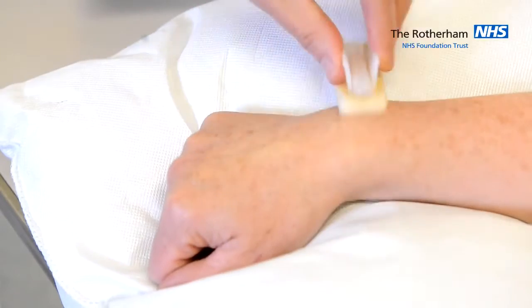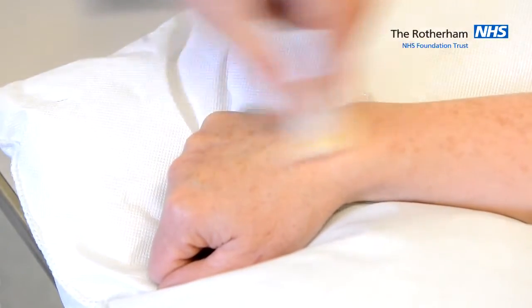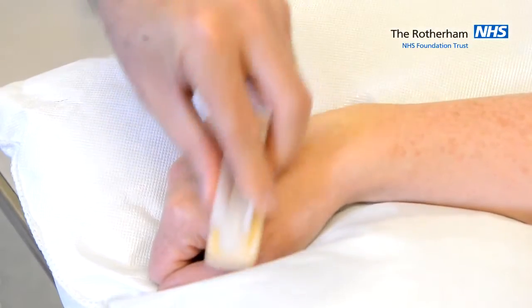Prior to cannulation, clean the skin with the chlorhexidine and alcohol impregnated sponge for 30 seconds in multiple directions, and allow it to dry.